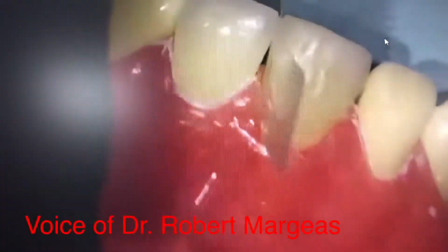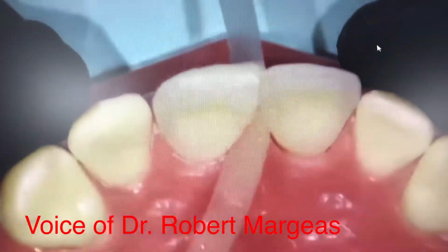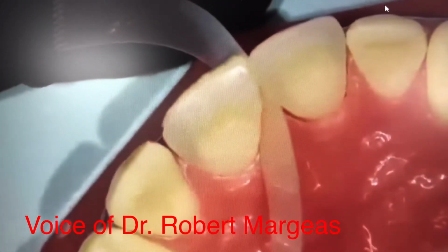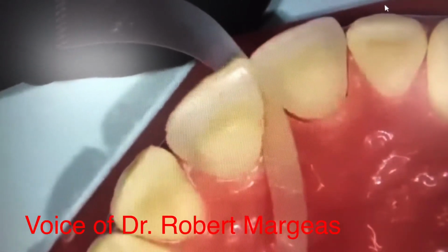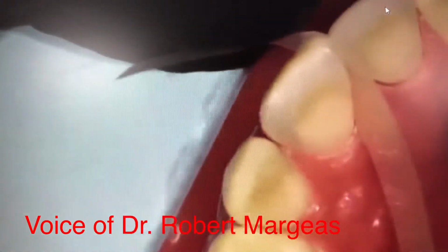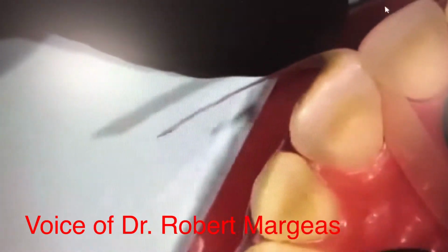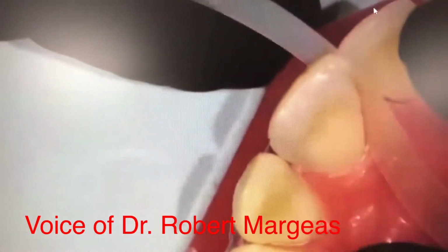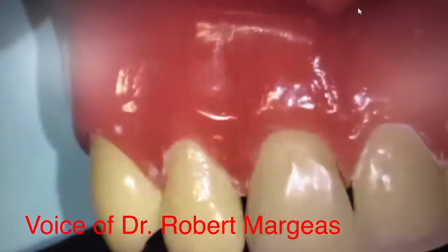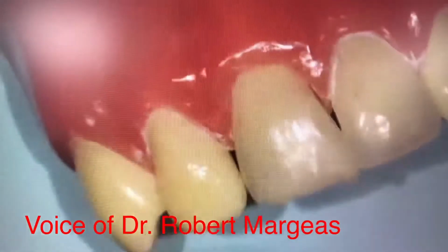Okay? So, now that I have that material like this, I want more material than I need. And what I'm going to do is my next pull through. I allow the composite to stick to the matrix. Now, if you're using a composite that's too sticky, the pull through technique does not work very well. Sometimes you may have to lubricate the matrix with a wetting resin. But for this Evanescence, it's a really good material to do a pull through, as is Filtech Supreme or the microfill from Renamel. So what I'm going to do here is this. I push, pull, push, pull, push, pull, and then I do this really fast, so that I don't have any overhangs, and I'm going to have a nice contact.